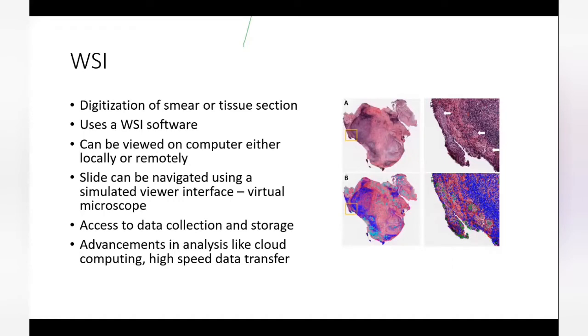This is pretty much the best way and fastest way to do it. We're not wasting anybody's time, and we'll also be able to get a quick, accurate, expertise-based reporting much faster. So you can just imagine what that means for the patient or for the clinician. So that by far is the most important use of a WSI.